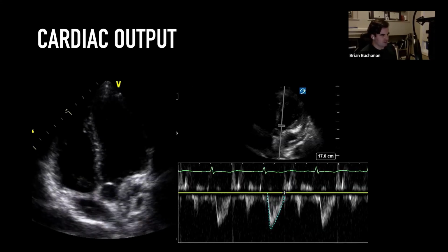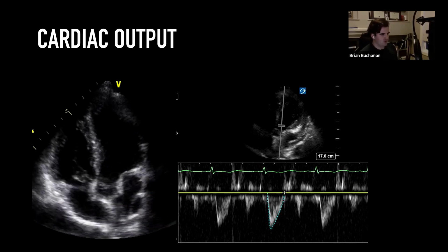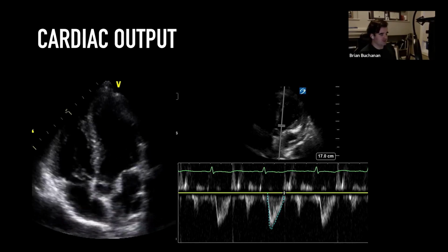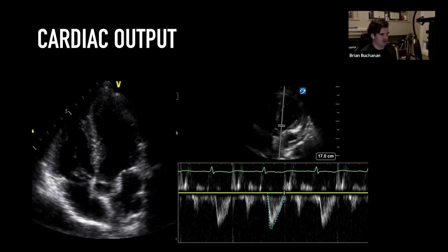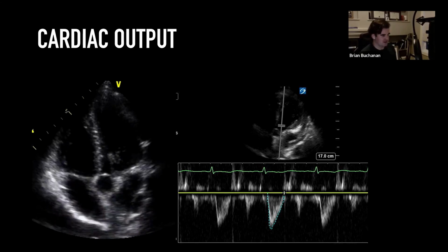So just to kind of round things out here, we've talked about pulse wave Doppler, we've talked about spectral Doppler, we talked about how we use the waveform, how we critically appraise the waveform, and how we trace it, and then finally, how we actually interpret that waveform in the context of the patient. Is there anything else you want to talk about, Jean, from this standpoint?